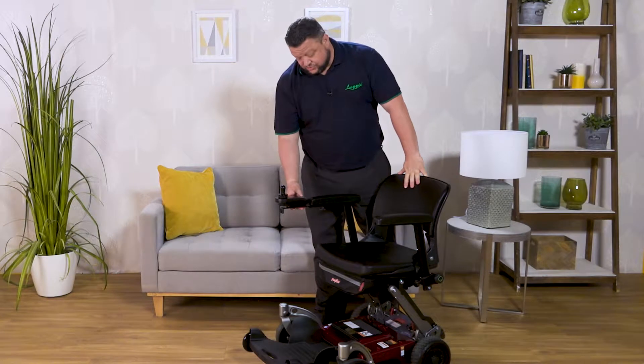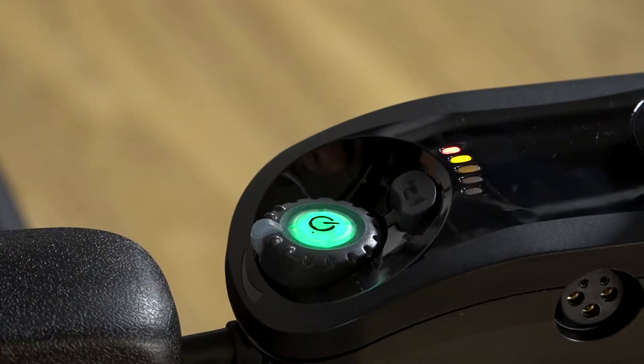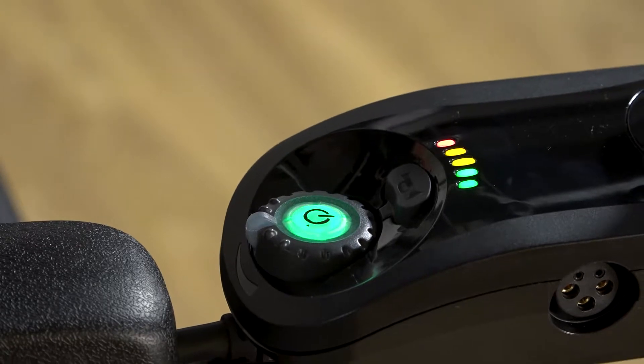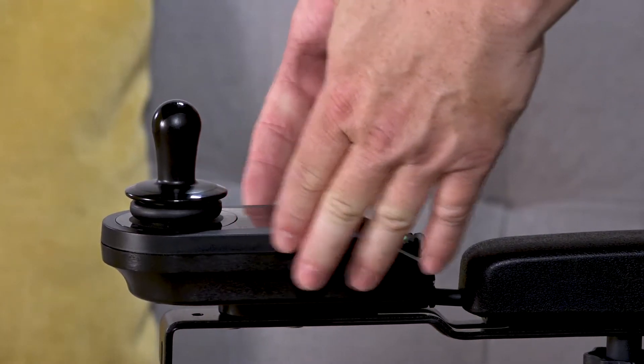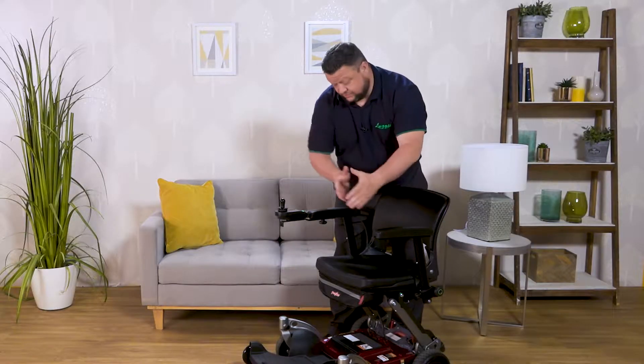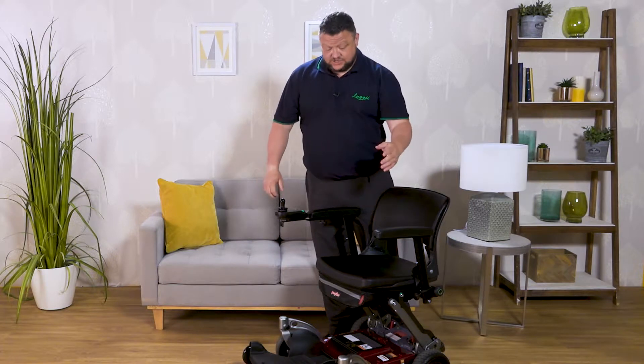When we come to the controls, we have a simple on-off button just on the joypad there. The joypad can be removed from the right-hand side and fitted onto the left, or vice versa. Obviously if you're right-handed you have it on the right, if you're left-handed you have it on the left.